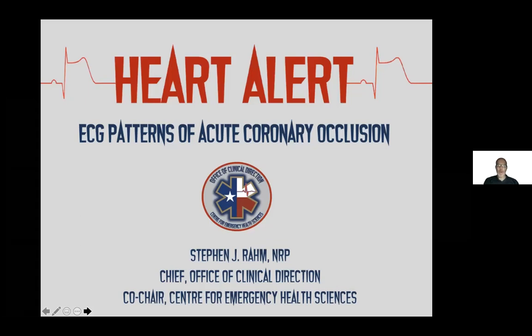We're going to talk about a topic that, if you follow folks on Twitter like Dr. Stephen Smith, Amal Mattu, and Tom Bouthillet out of Hilton Head Island, South Carolina, I'm sorry about that, Tom, is about patterns of acute coronary occlusion. I title this Heart Alert because in our region, if a patient needs to go to the cath lab, we don't call it a code STEMI, we call it a heart alert. And I'll elaborate on that.